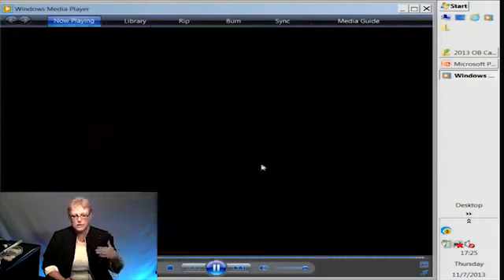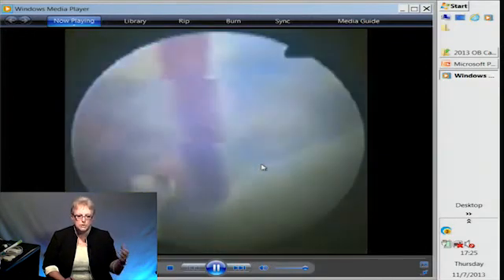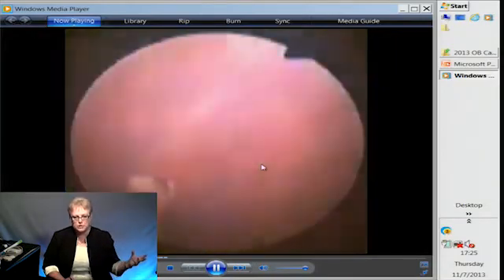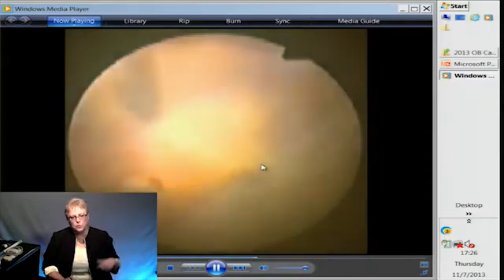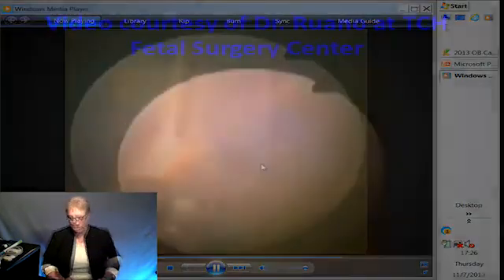So our job during that time is to look at, if there's the poly, then we're going to take some of the fluid out. And then just checking the heart rates while they're doing this. So there'll be times where they're running the laser ablation, and then other times where we're stopping so that we can look at the heart rates. We are monitoring those every 15 to 20 minutes. We stop and look at everything.